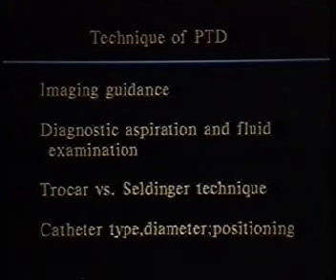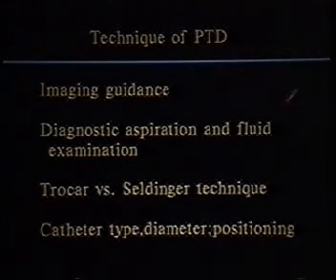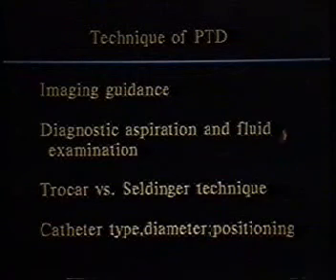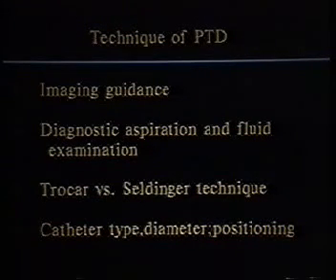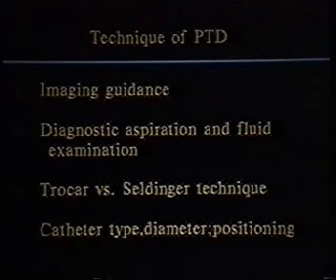If there's a question as to whether the fluid collection is infected or is indeed an empyema, then we can always send the material for the appropriate gram stains or cultures or chemistries, and then either directly proceed to drainage once those results are back, or bring the patient back to the radiology area after it's determined that the patient requires percutaneous drainage. The choices of using either a trocar or a Seldinger technique, again, varies from person to person.